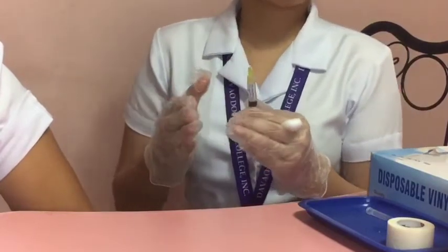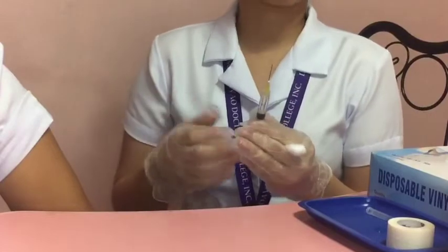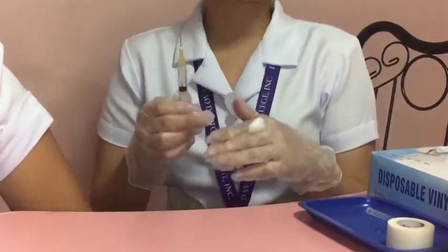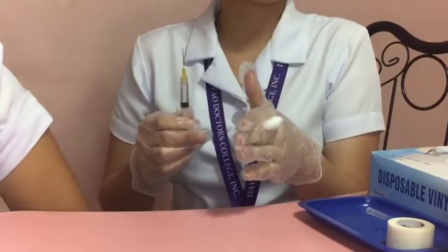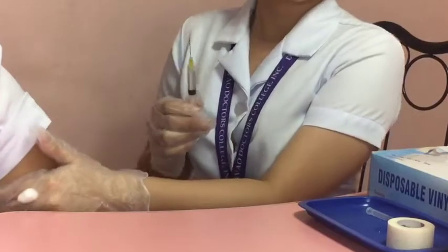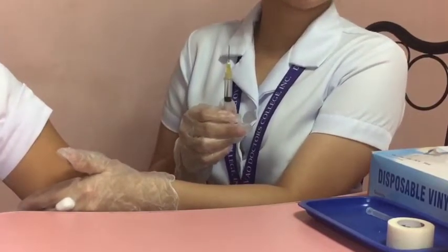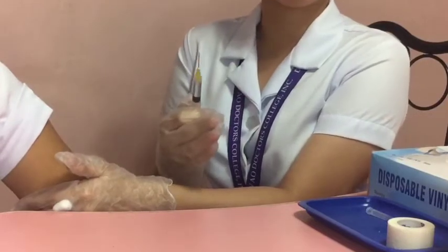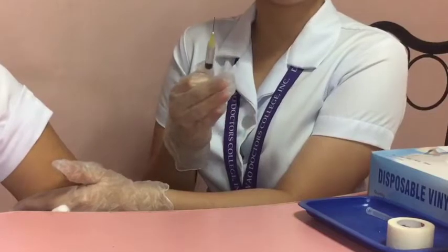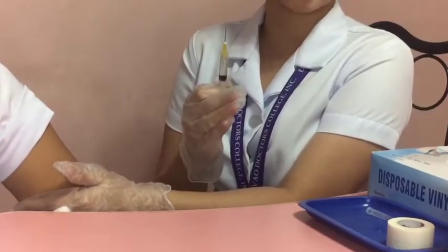So now, I am going to use the Z-track technique. Using the ulnar side of the non-dominant hand, I am going to pull the skin approximately 2.5 cm to the side. Under certain circumstances, such as for an emaciated client or an infant, the muscle may be pinched. Pulling the skin and subcutaneous tissue or pinching the muscle makes it firmer and facilitates needle insertion.